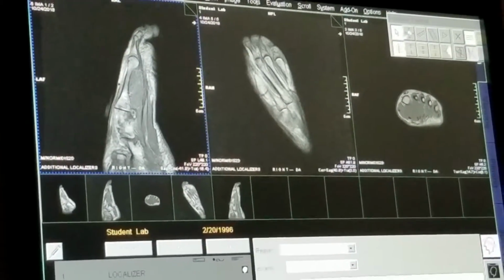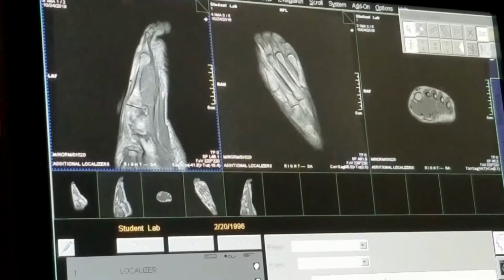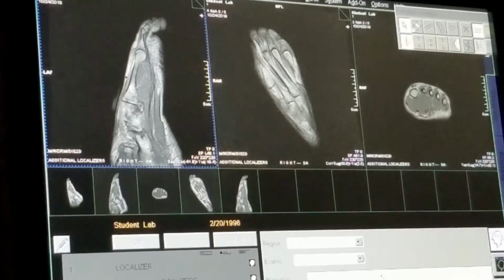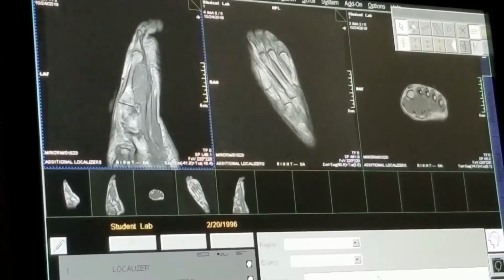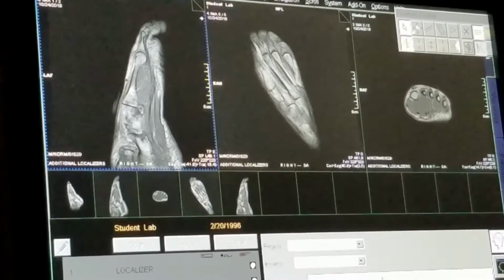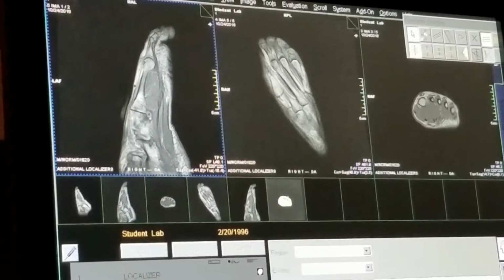Now this is definitely a lot of scouts, but if you don't prepare ahead of time, your obliquities will never be as accurate as you want them to be. And when it comes time to utilize your second localizer, the yellow box, it'll be more of a true representation of what you're angling to versus something that's obscurely angled.